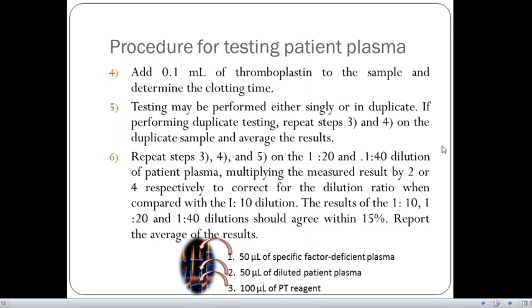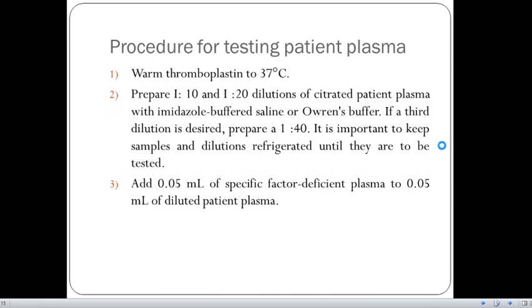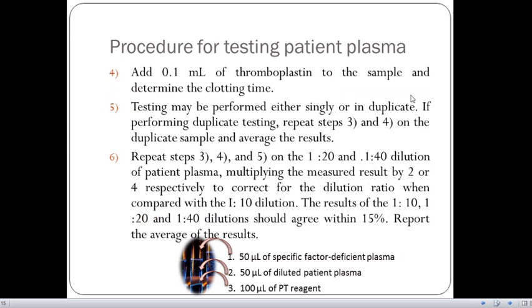Continuing with the testing of the patient plasma, we have to add 0.05 ml of thromboplastin to the sample and determine the clotting time. And then testing may be performed either singly or in duplicates. Similarly with the test that we have been doing in the first set, repeat steps 3, 4 and 5.